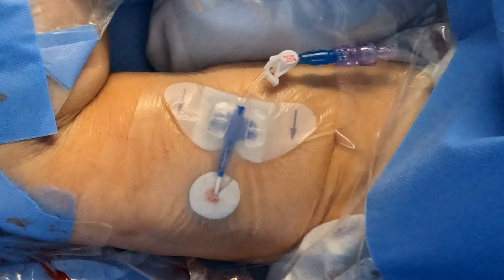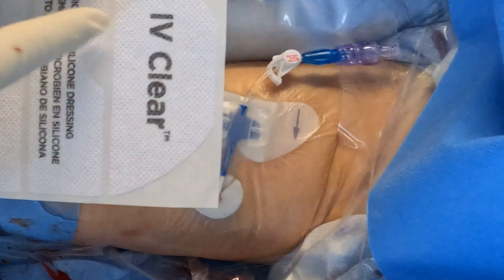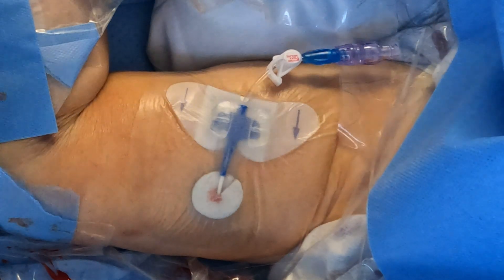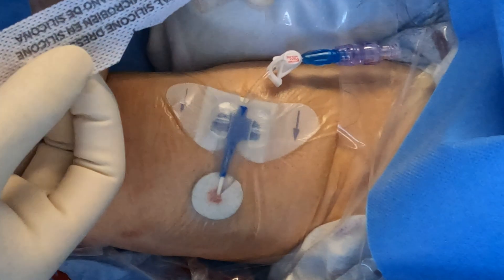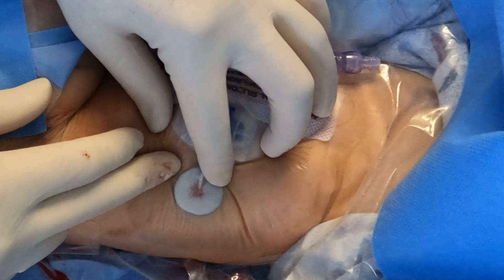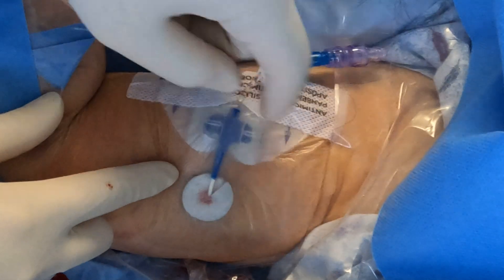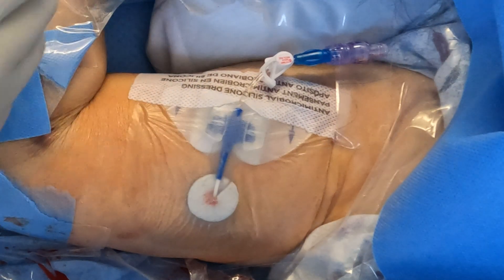Look how smooth that looks. You could use these reinforcement strips to help secure, but remember — this part is acrylic and this part is silicone. So if your patients have allergies to acrylic, you do not want to use these reinforcements. The Covalon IV Clear dressing has CHG already in it, so it's going to have its antimicrobial effect as well.